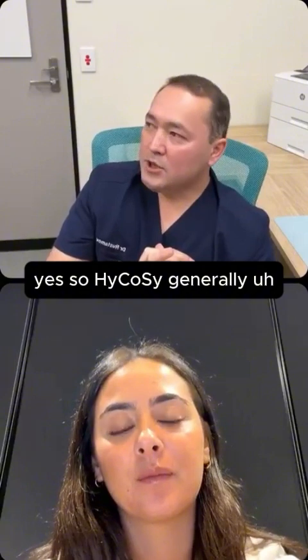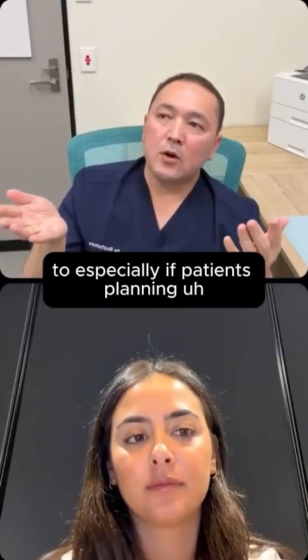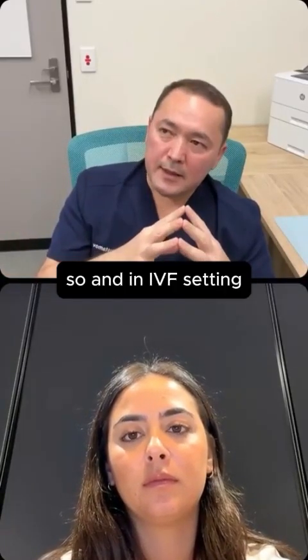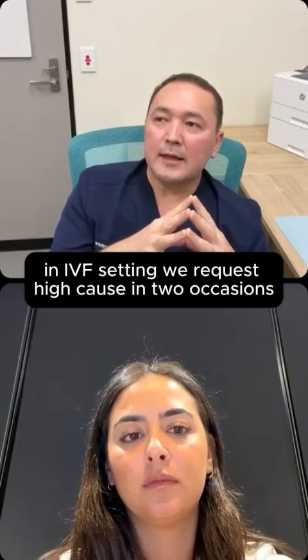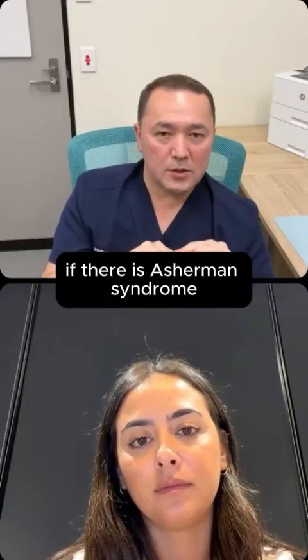Yes, so HyCoSy generally we do before IVF, especially if patients are planning ovulation induction or IUI, to ensure that the fallopian tube is open. And in the IVF setting, which is what our live stream is dedicated to, we request HyCoSy on two occasions. The first occasion is to check if there is Asherman syndrome.